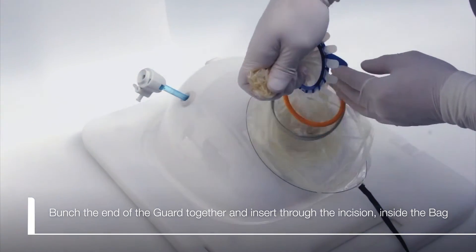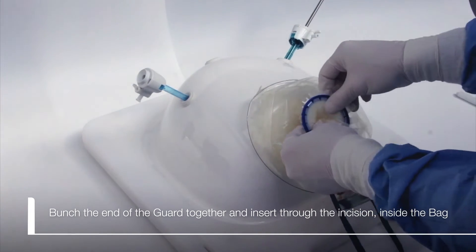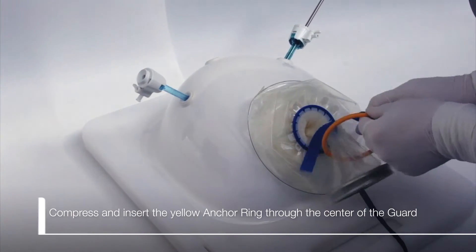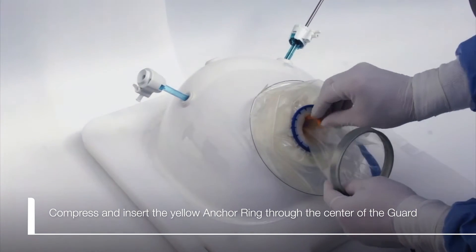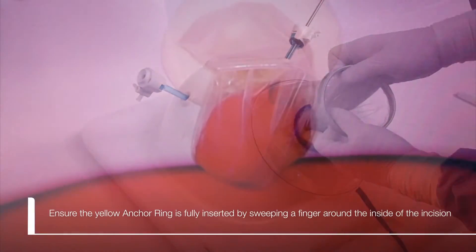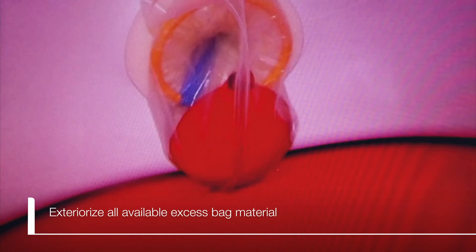Bunch the end of the guard together and insert through the incision. Insert the yellow anchor ring through the center of the guard. Ensure the yellow anchor ring is fully inserted by sweeping a finger around the inside of the incision. Exteriorize all available excess bag material.